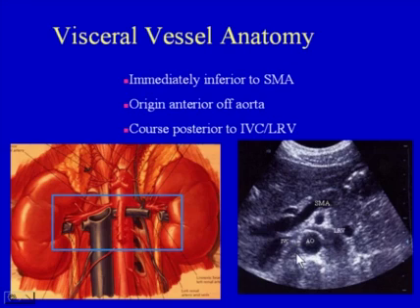We see the aorta. Now you don't see the renal arteries, but they are located slightly posterior to the renal veins. But now you've narrowed down your field of view in which you need to search for the renal arteries.